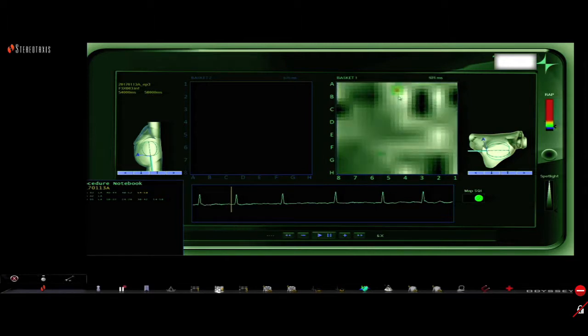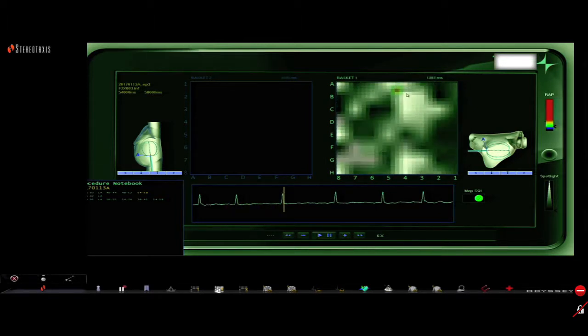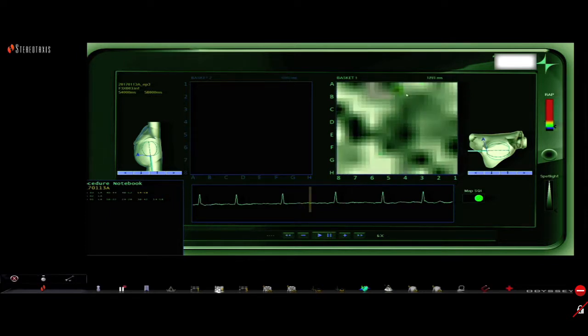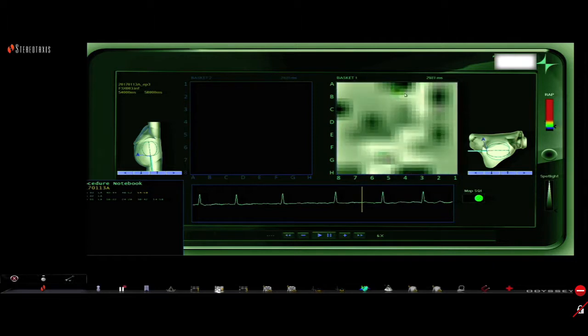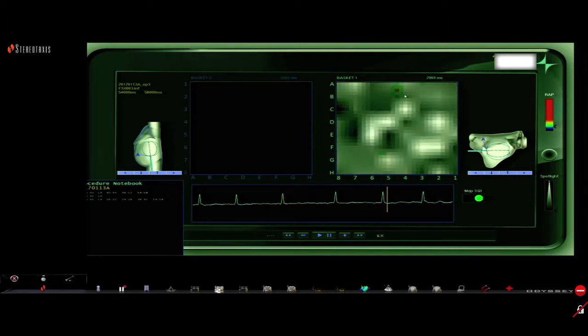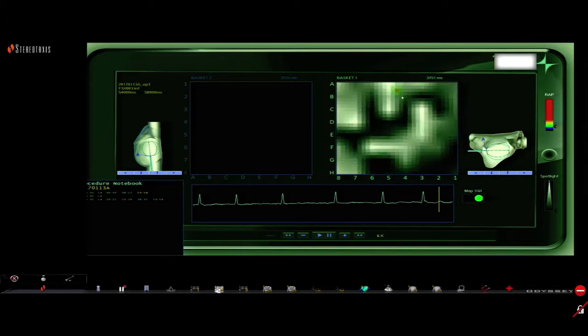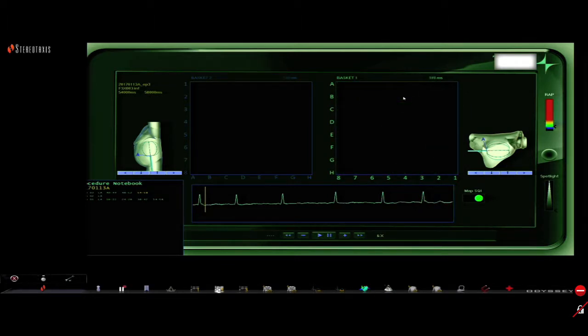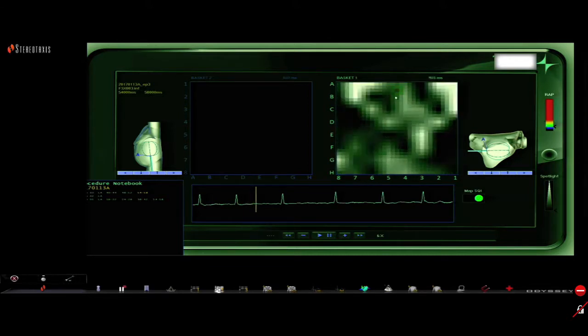And if the patient is in AFib, you will do cardioversion and then check all the veins. At the end of the procedure, if the patient has terminated, we will then cardiovert and make sure that he has persistent pulmonary vein isolation. Okay. Thank you, David. It's a very nice case.